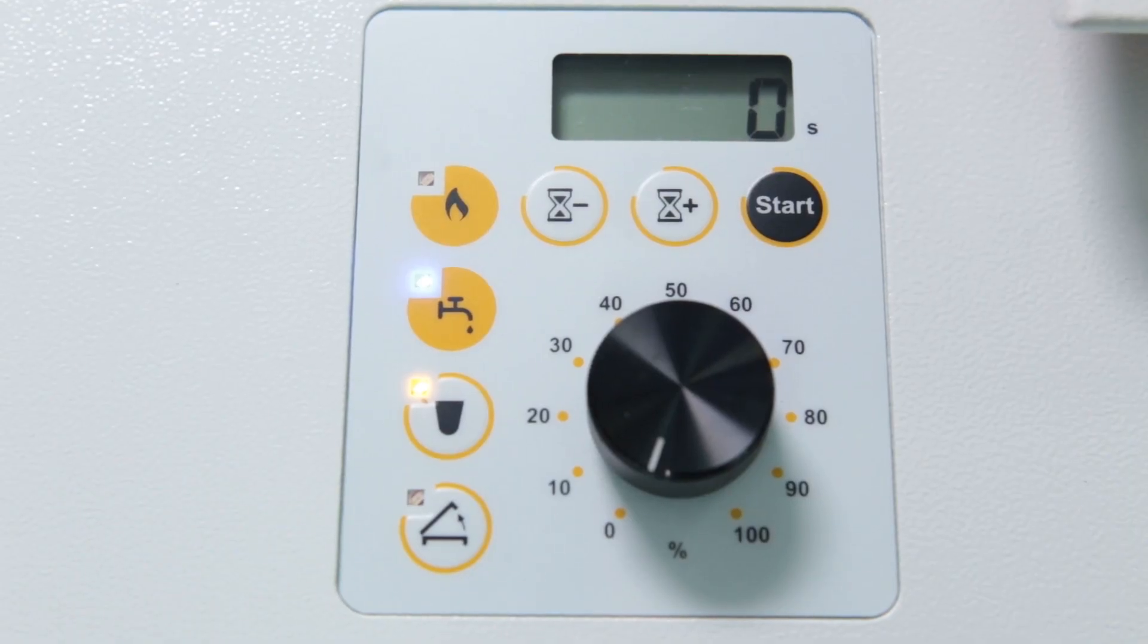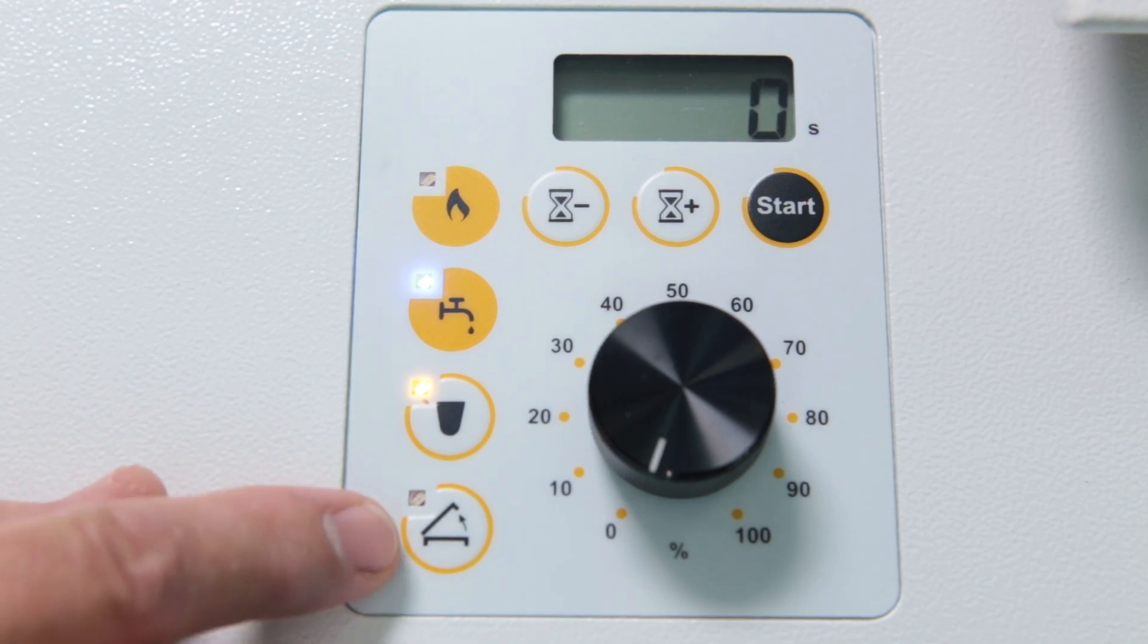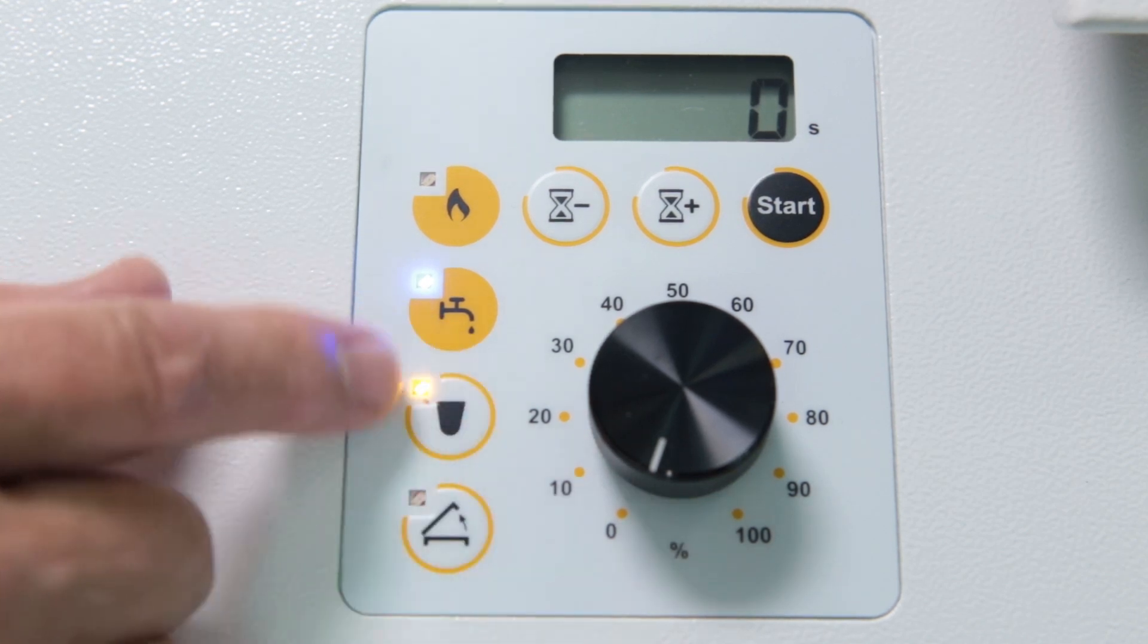This is the operating panel of the Fornax T, where all relevant functions can be set. This button shows whether the lid has been closed properly. It also opens the lid again, for example in order to place the mold.